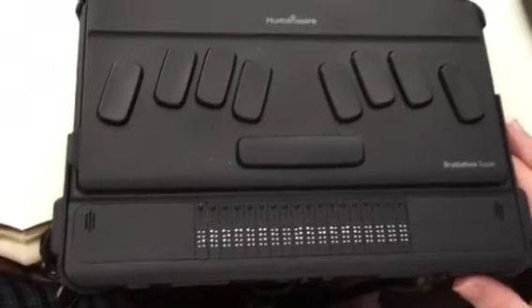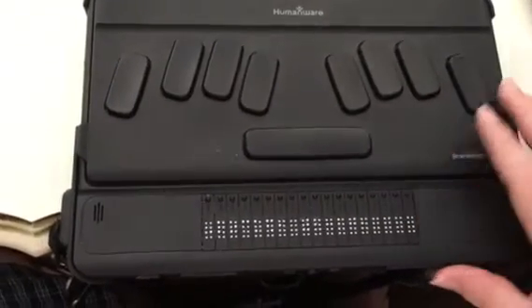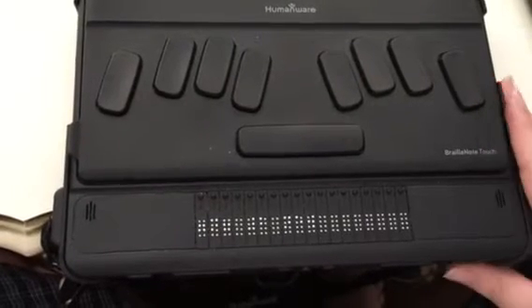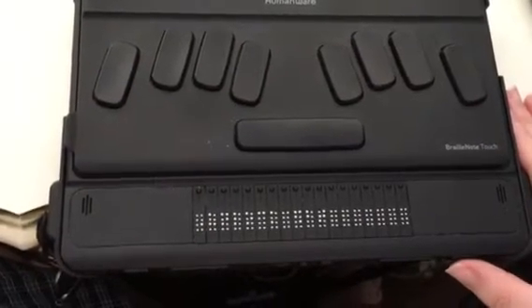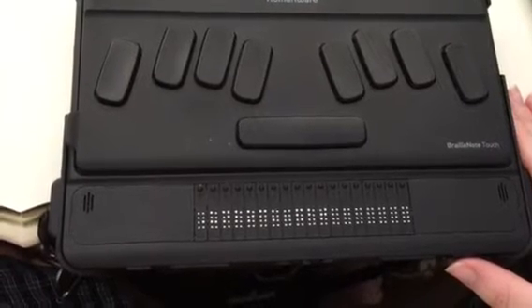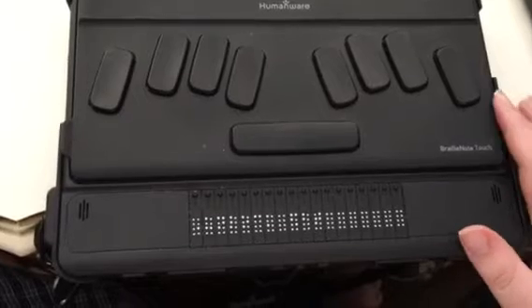Now sometimes, I've noticed it takes a few seconds. What you can do now is press your rightmost thumb key and find the unlock button and press enter.